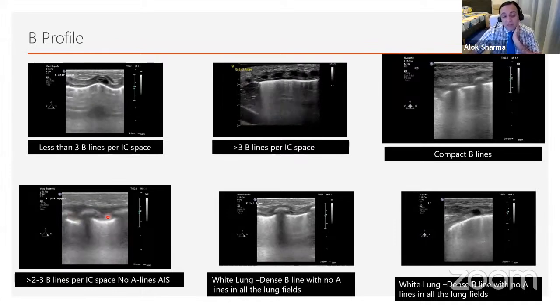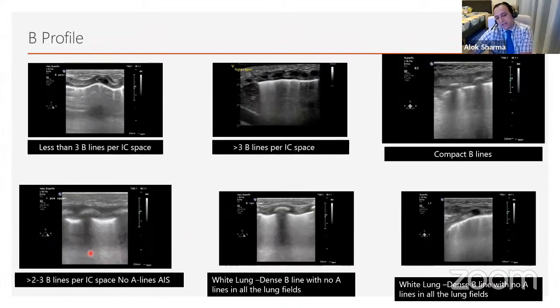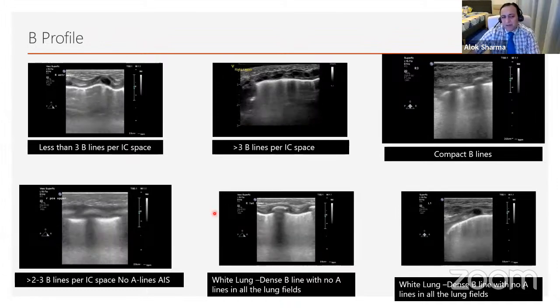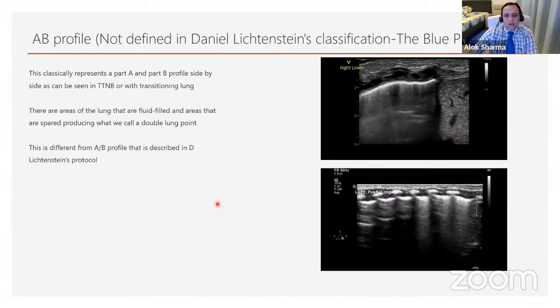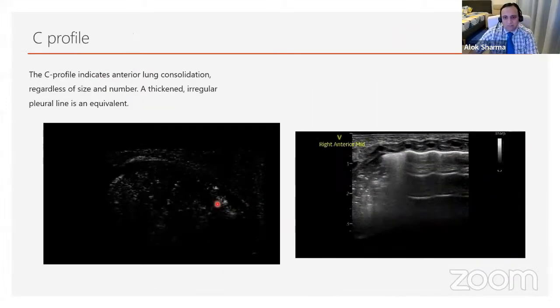So if you see that at the back of the lungs, what you'll probably get is this is the front because gravity causes fluid to settle. So you'll get an AIS pattern in the axilla in the back. So it's just progression of fluid. And my advice would be once you start doing lung ultrasound, when you go to the posterior regions, you'll see more of it.